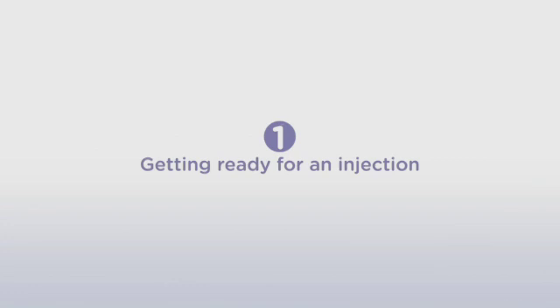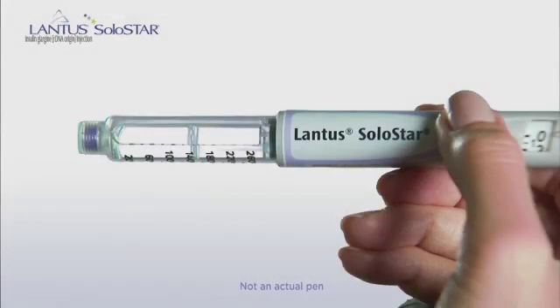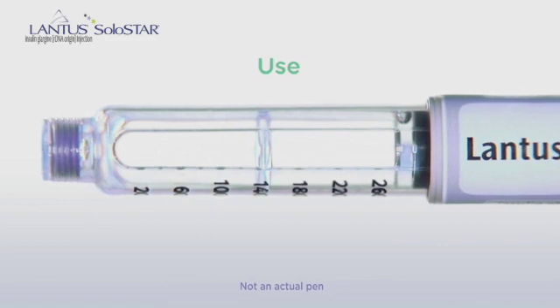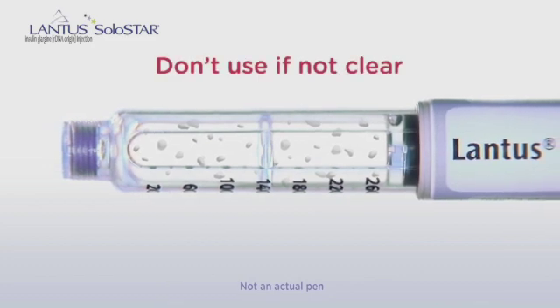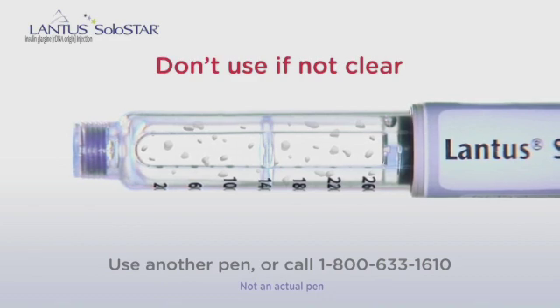Now let's go to Step 1, getting ready for an injection. Remove the pen cap. Before beginning, check to see that the insulin in the pen is clear and colorless. The insulin in this pen is clear, so it's okay to use it. If it is not clear, or if it has particles, do not use that Lantus Solostar pen. Use another pen, or call the 24-hour helpline at 1-800-633-1610.